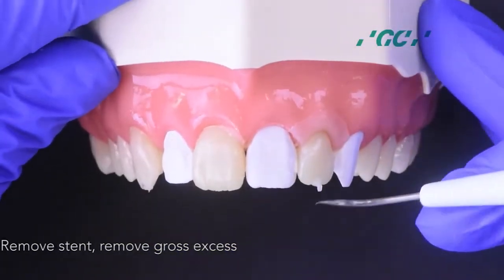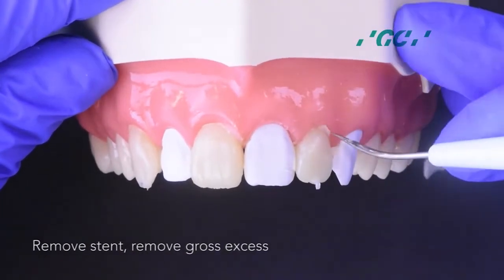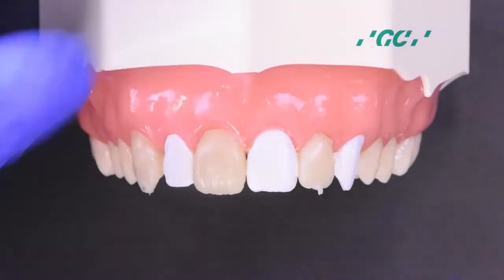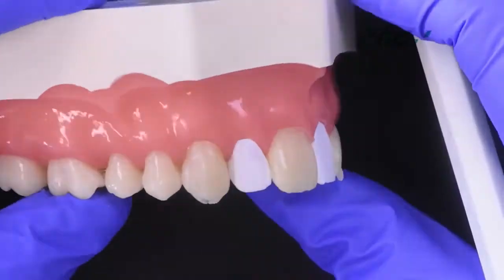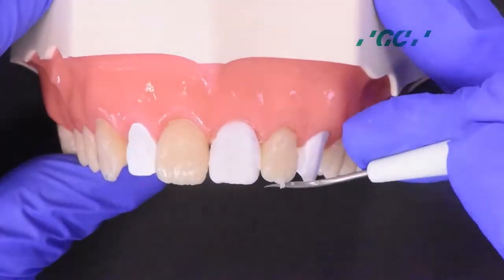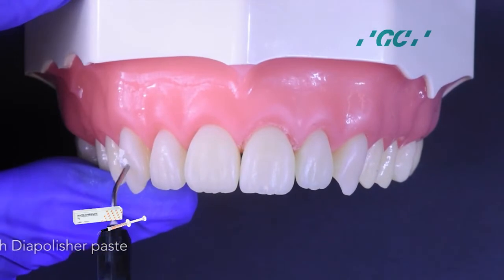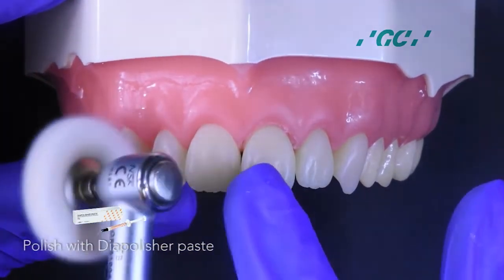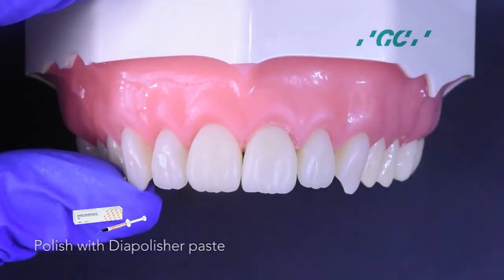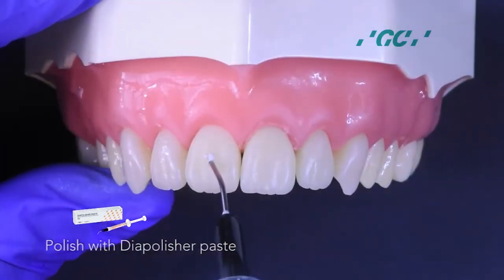Take out the stent and remove the gross excess. Polish with Diapolisher paste. Diapolisher paste is a diamond paste containing super fine diamond particles that gives the perfect glossy surface with high luster.